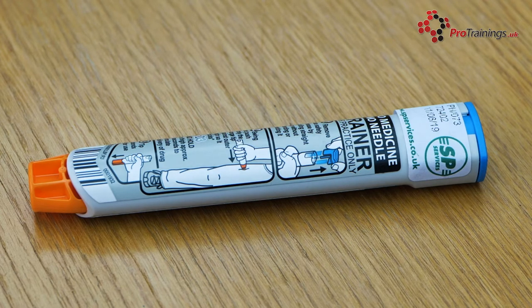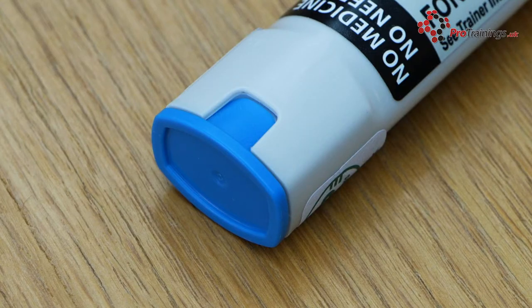The blue cap at the top of the EpiPen is the safety cap, which makes sure that the needle does not accidentally protrude when not in use. Once this cap is removed, the unit is live. The cap can be replaced without the EpiPen being used; however, you must do so carefully as you could inject yourself accidentally with adrenaline.